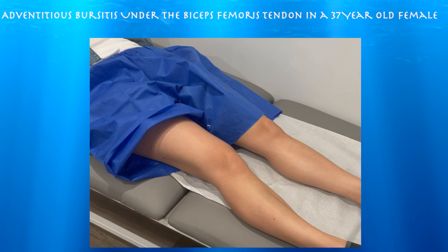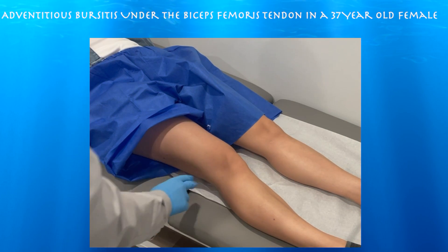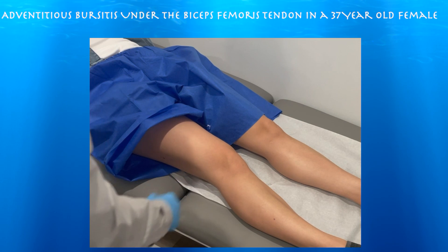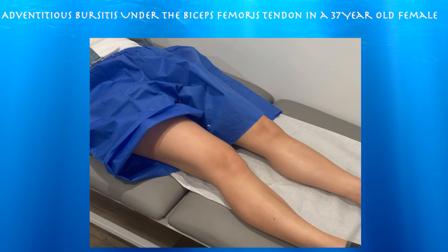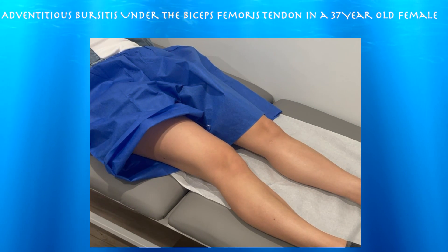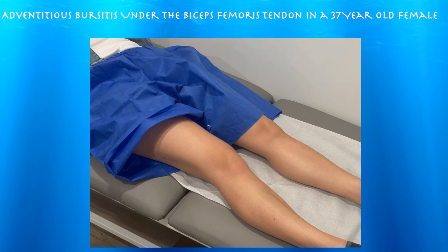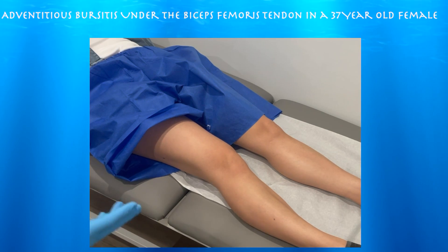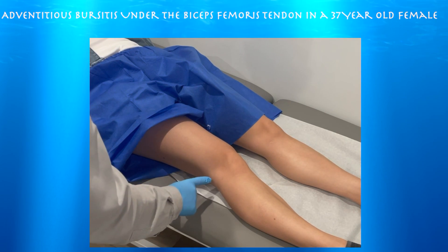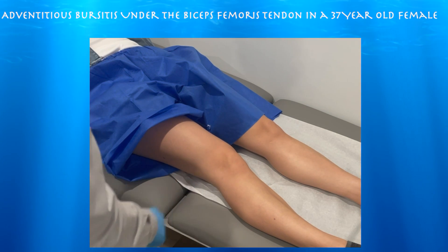37-year-old female here for pain in the right knee. She won't sleep over the lateral, kind of going on for three weeks. She was a runner up until about three months ago but she stopped because she doesn't like running in the cold weather. This developed after she stopped running — she has pain mostly going up and down stairs in this part of her knee.